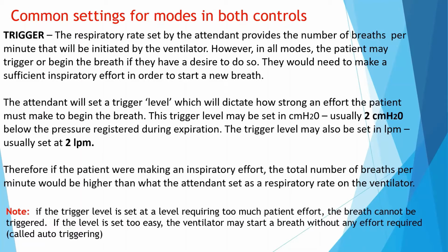Note, if the trigger level is set at a level requiring too much patient effort, the breath cannot be triggered. If the level is set too easy, the ventilator may start a breath without any effort required. This is called auto-triggering.